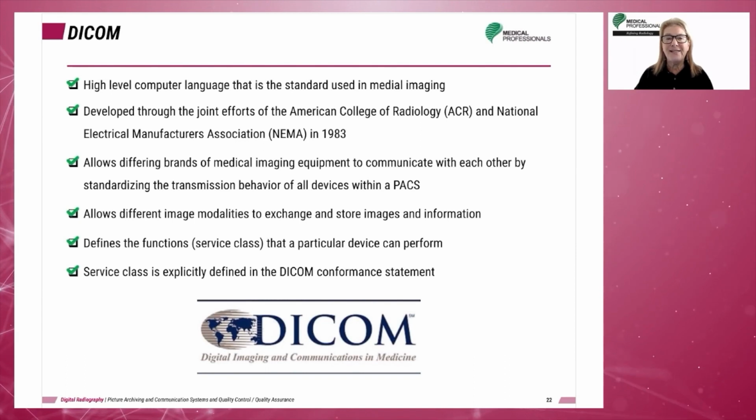Prior to 1983, computers used in medical imaging departments used vendor-specific software for image acquisition and display. As PACS became the norm in medical imaging departments, and with multiple vendors and equipment types in the marketplace, all operating on their own software language, problems arose.